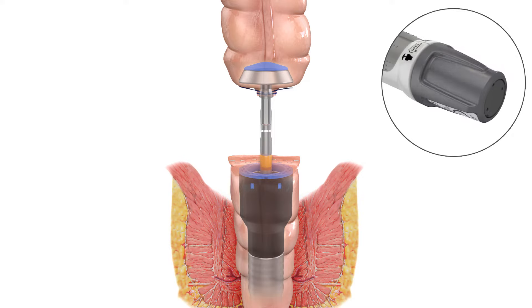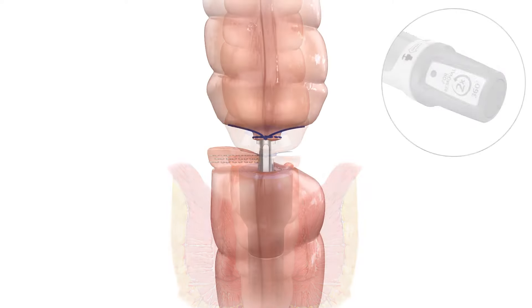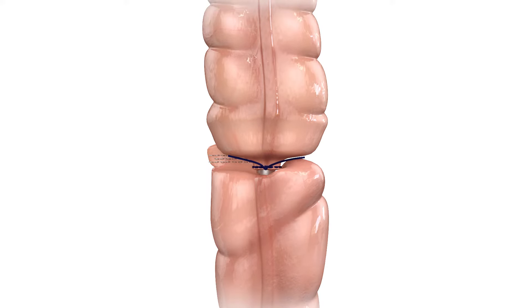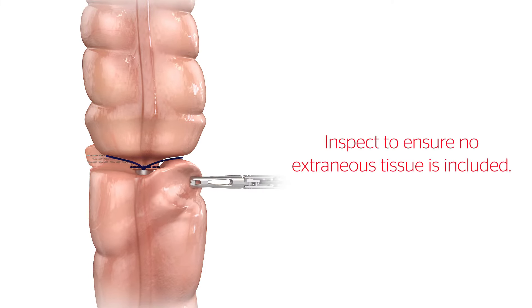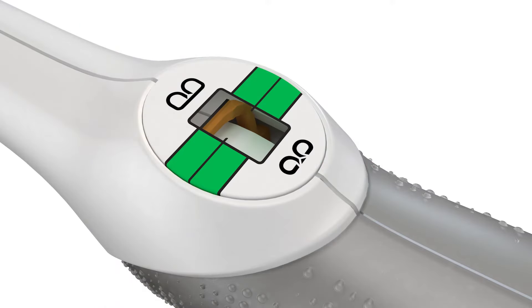Close the device by rotating the adjusting knob clockwise. As the device closes, it is important to ensure the tissue remains in the proper orientation and no extraneous tissue is included. Tissue thickness may vary even within a single patient's GI tract.